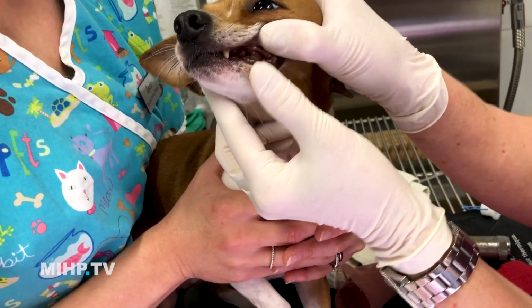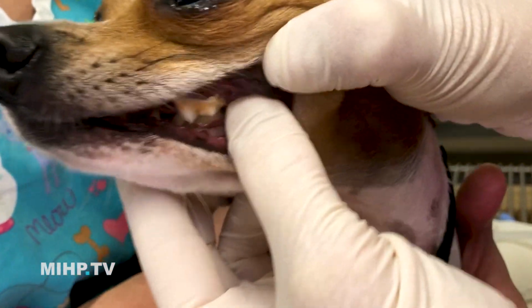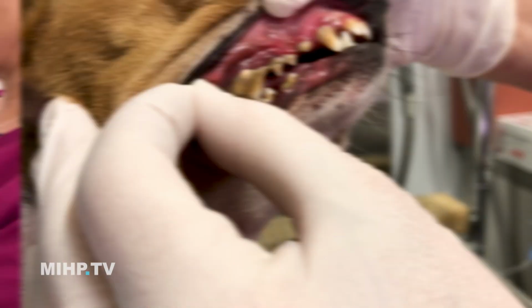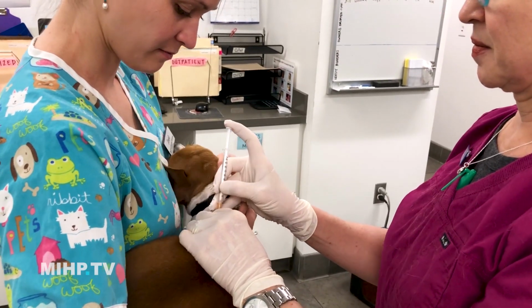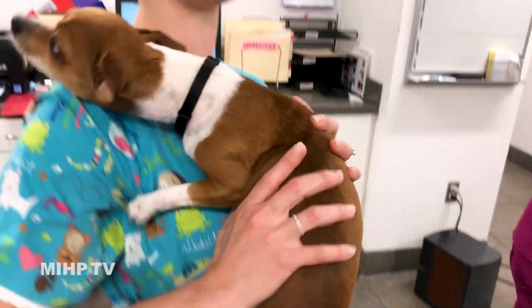Okay. She's got a little bit of tartar. Okay, they're not too bad though. A little bit of gingivitis up here too. Oh, good girl. She's so nervous she doesn't even know.